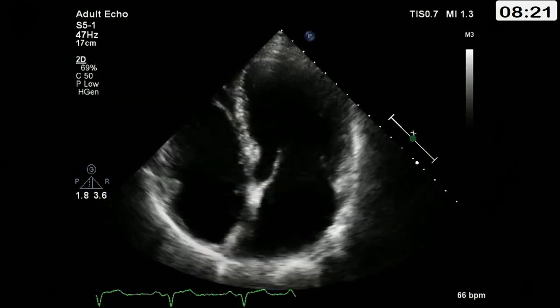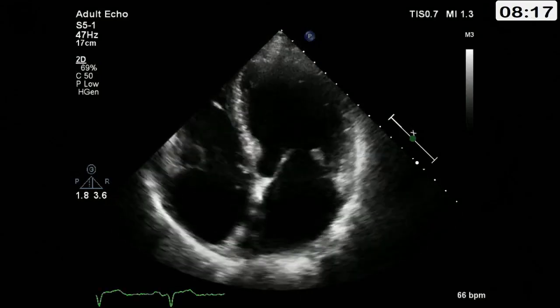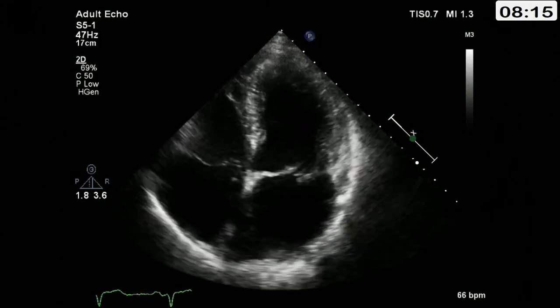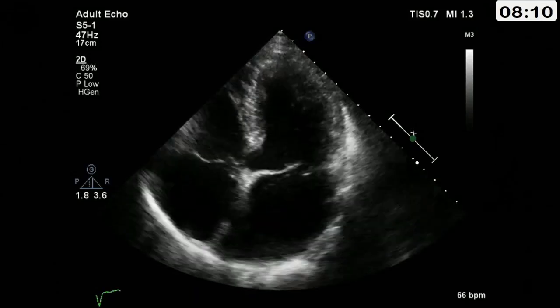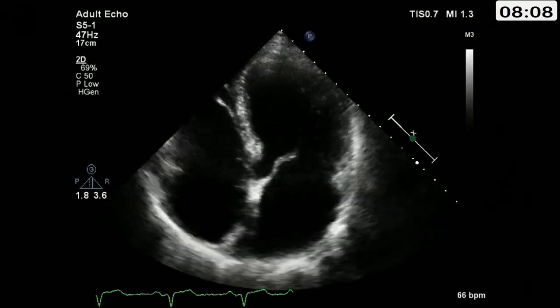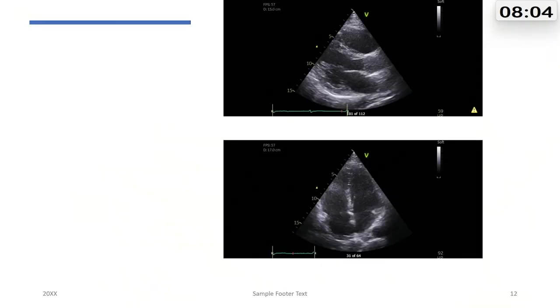Let's move on to another case. The patient has some mitral problem, and you could look at the LV, it's quite hyperdynamic. It's actually an acute rupture of the mitral, but that's not the point. The point is that you can assess the left ventricle very well here, anyone can, even if you've done 2 months of residency in cardiology. But the RV, well, I can see the apex of the RV, but we can't assess it. The patient has COPD, so it's quite difficult imaging.